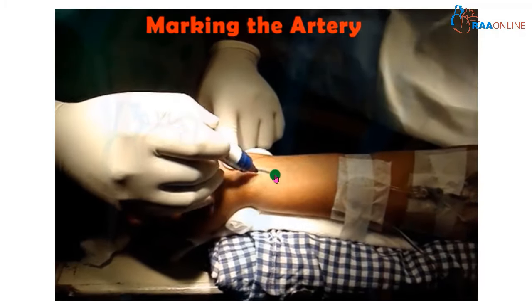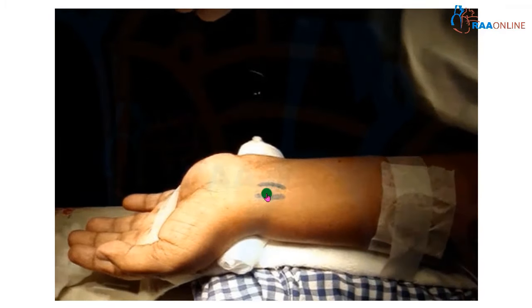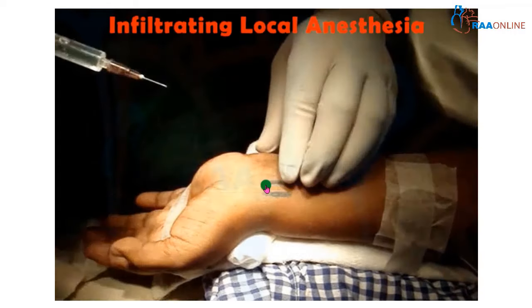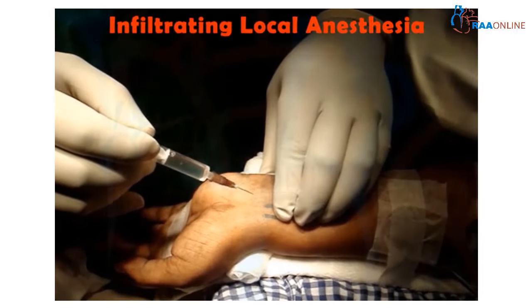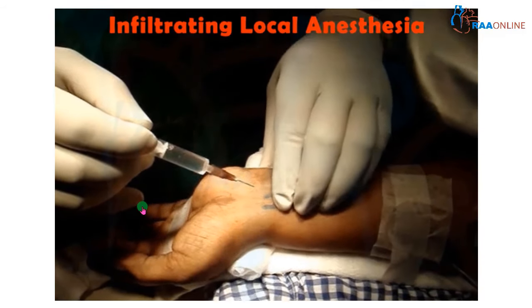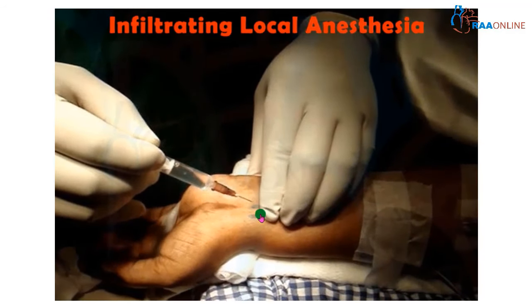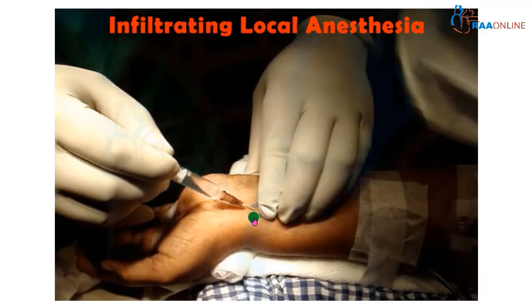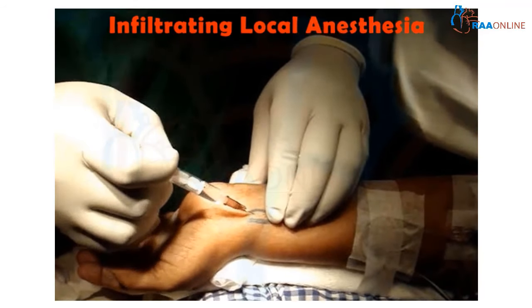For demonstration purposes, I am marking a line over the radial artery — this is the area through which the artery is going. The next important part is local infiltration. You have to give good local anesthesia so that the patient does not have any pain. Here you can see a nice wheal is being developed with local anesthesia, which will relieve the pain as well as locally vasodilate the radial artery.